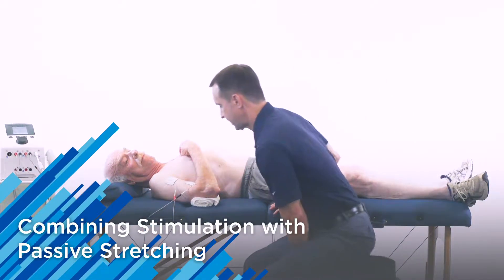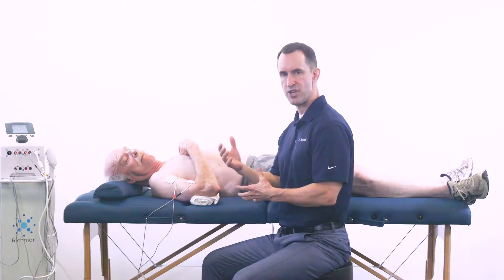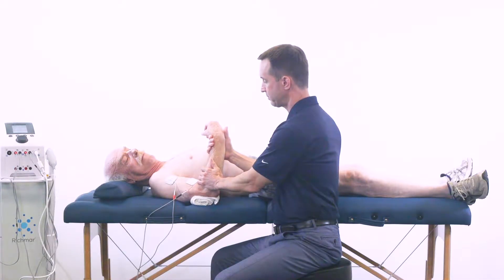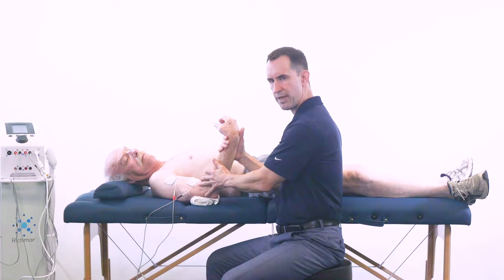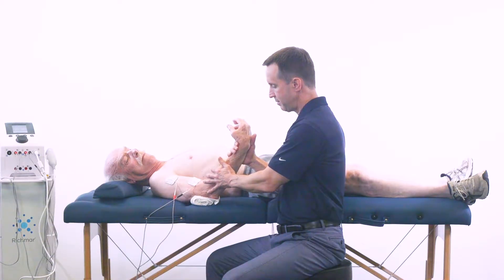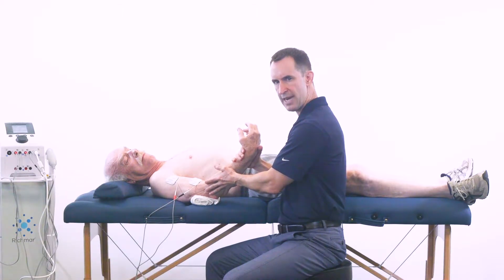As the stimulation starts to take effect, the hypertonicity of the bicep will start to relax and I can gently move into more elbow extension as I work with the patient. The time it takes may vary for patients depending on how much hypertonicity is involved. You'll notice that nice gentle movements will actually help move the patient's elbow into more extension. If I move it too quickly, the patient could activate the stretch reflexors of the bicep and force it to contract.